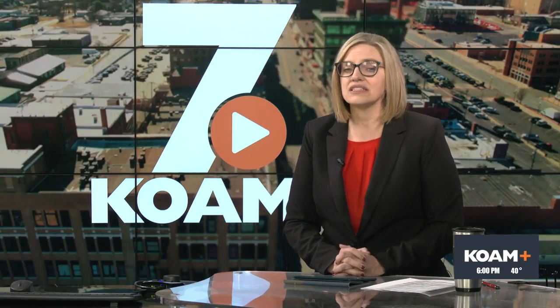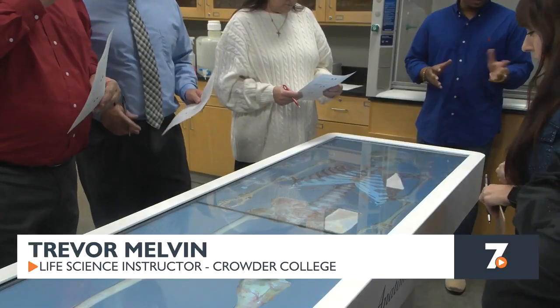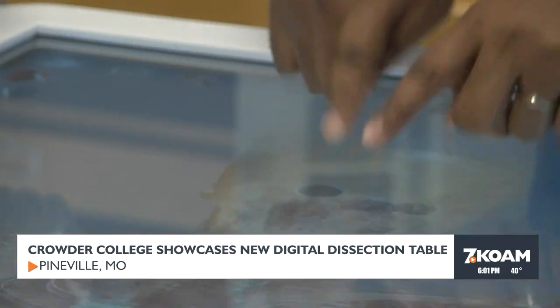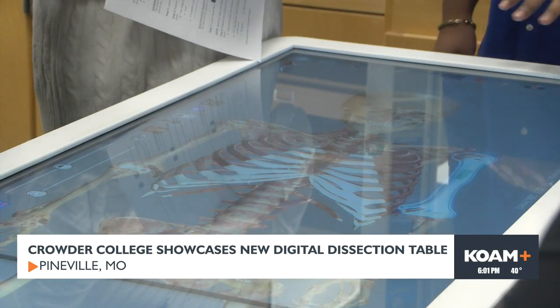Now, viewers should be advised, this story features detailed medical procedures. There has been a lot of oohs and ahs and a lot of gasps, and it's really been exciting. The reason for all the reactions at Crowder College is their new Anatomage table. The table is a digital cadaver lab that uses images from real human bodies.